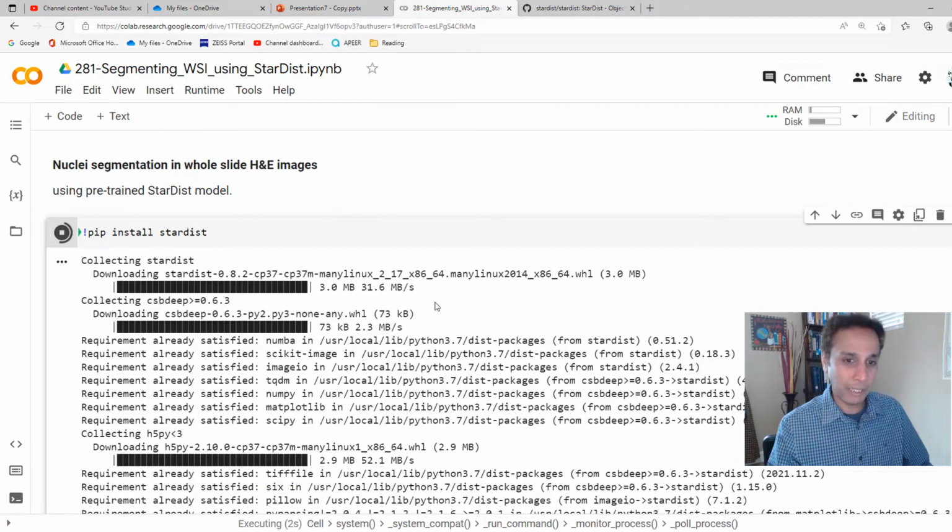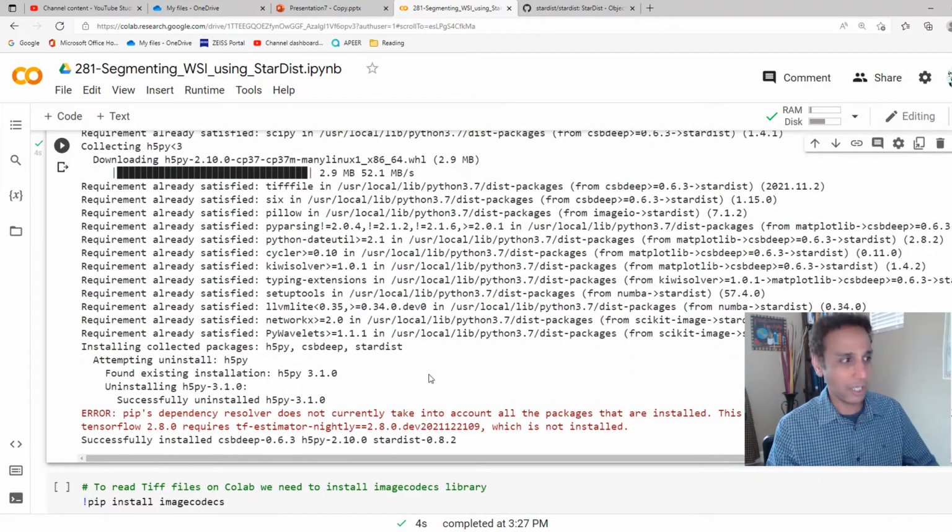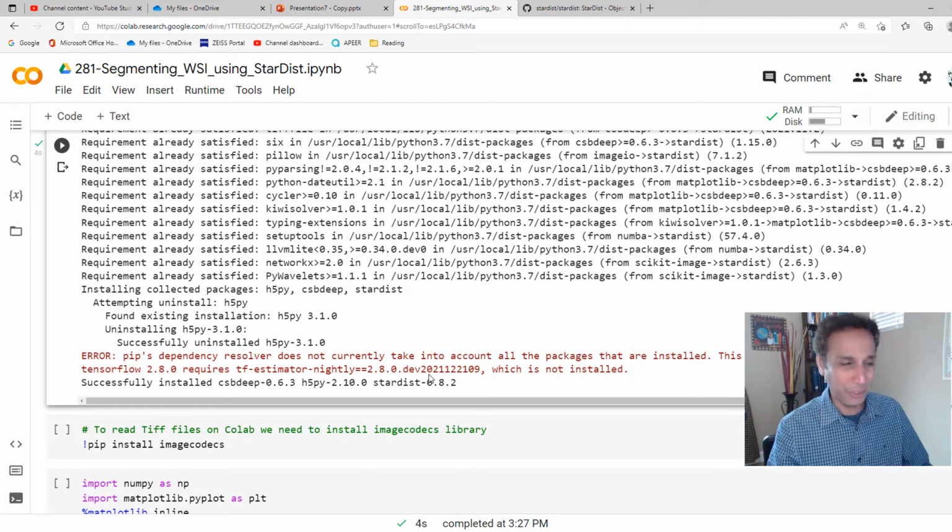So hopefully sometime around May 2022 timeframe, I'm recording this. Probably you'll see this sometime in June timeframe because I still need to edit this and schedule it. There's a lot of stuff that goes into publishing a YouTube video, but probably you're watching this sometime in June timeframe, so it's relatively current for you. Okay, so that got installed.